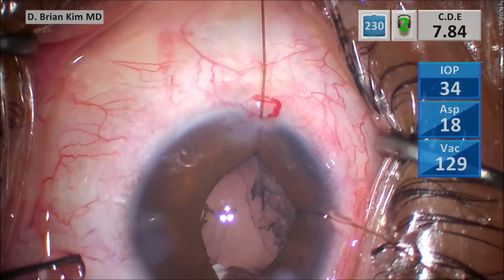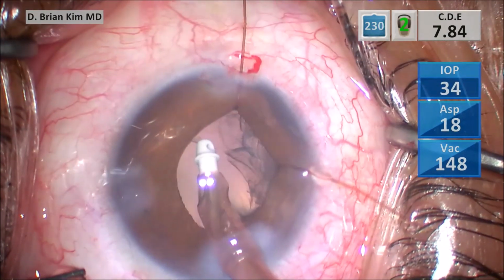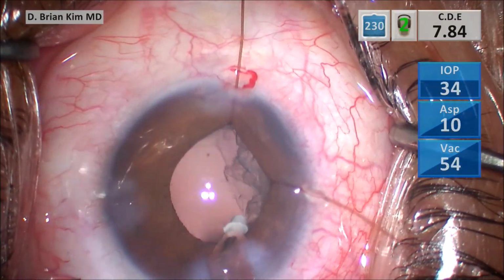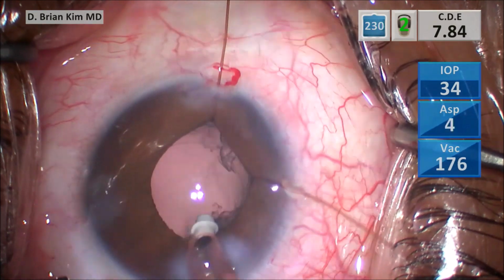And you're going to see how the capsular bag behaves in the area of iridodialysis as I try to peel the cortex in that area. So far so good. I'm able to peel the cortex successfully and effectively. And why? Because in these areas, the zonules are strong.